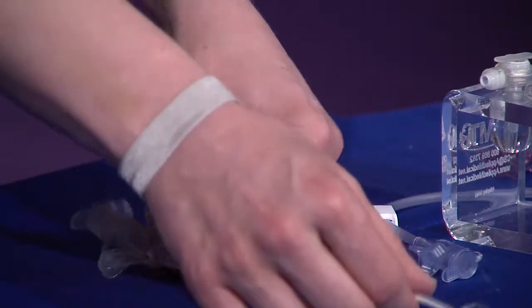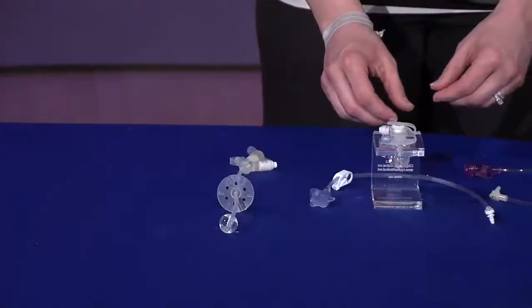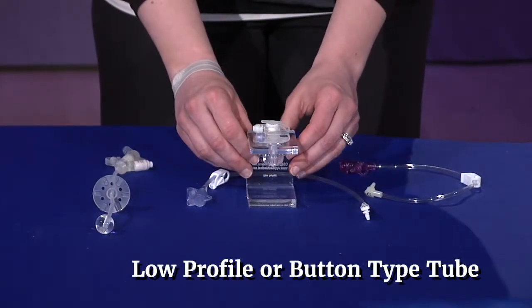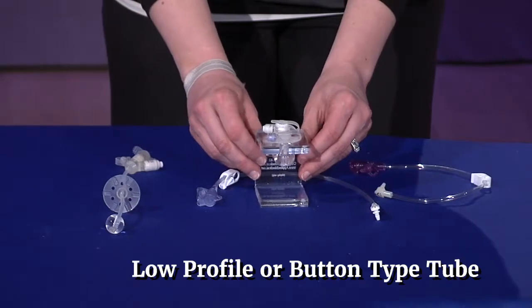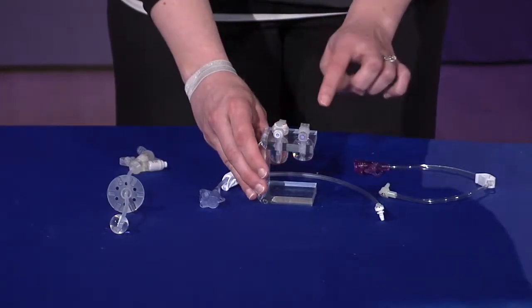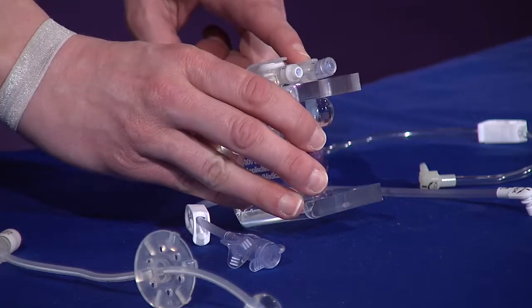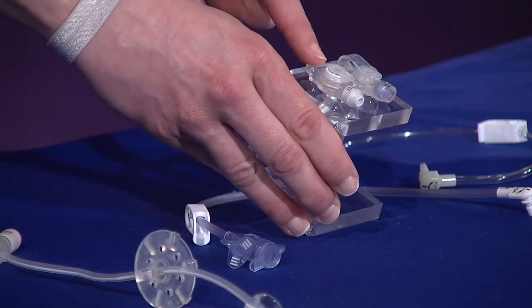The next type of tube is the low profile or button type tube. These are balloon type tubes. There are 2 different brands, the Mickey button and the AMT Mini 1 button. For this video, we will be spending most of the time demonstrating on the Mickey button.